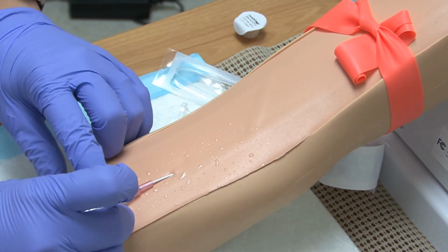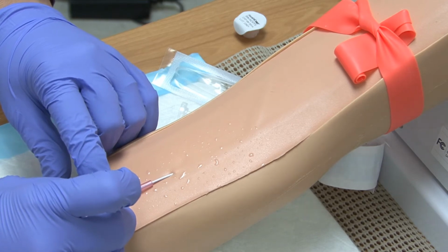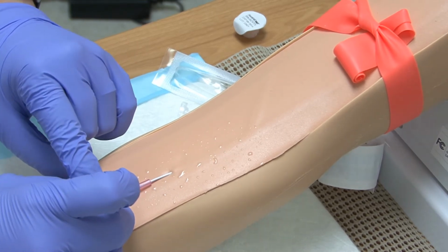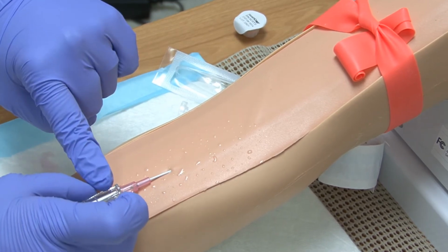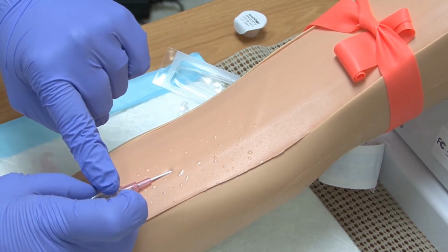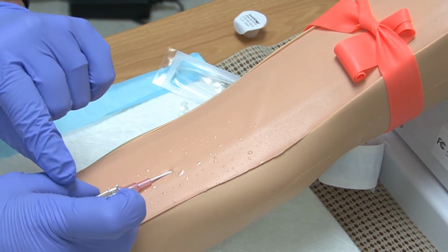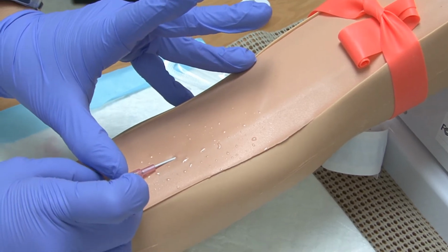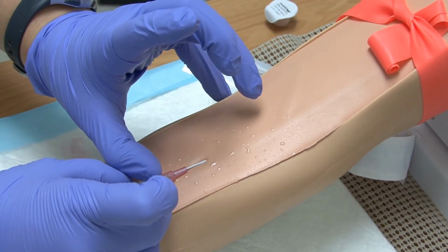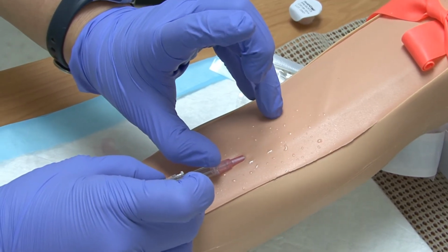So when you see the flash, you would see flash or blood return here in this area. Once the blood is here, you do not want to advance the needle anymore. Then you want to advance only the plastic catheter. So what I'm going to do is, with this hand, continue to stabilize the IV. And with this hand, because you use a two-hand technique, you're going to insert the catheter up to the hub. And you see how I did that.